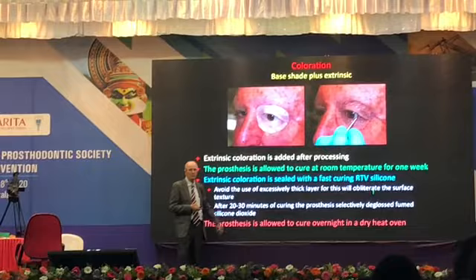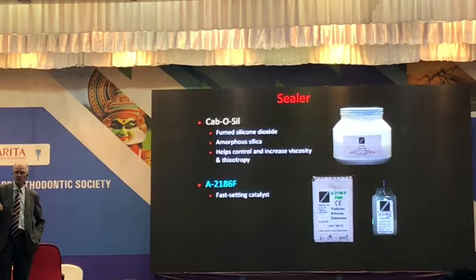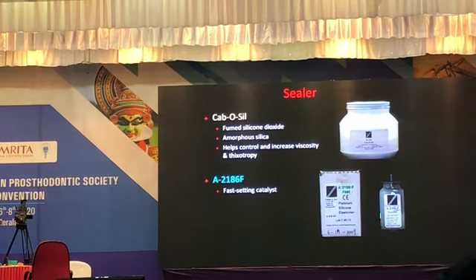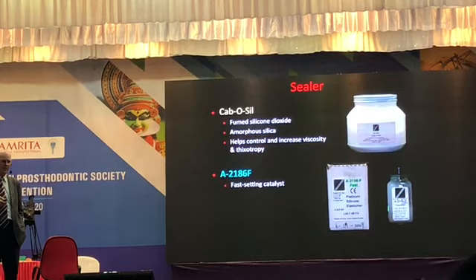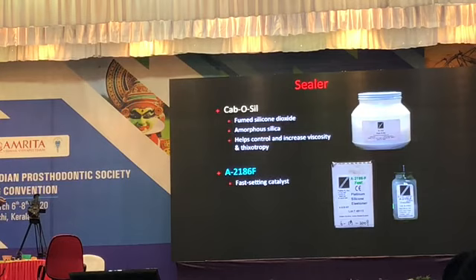And then you seal it with an auto-polymerizing silicone, and then you have to degloss this. When you seal, the surface will be excessively shiny, and so you have to use a material to eliminate that shininess, or at least moderate it somewhat. And noses sometimes will let it still shine on the nostrils a little bit, and maybe the tip, because a lot of older people have a lot of sebaceous secretions, and their nose shine a little bit. You don't want to do too much elimination of the shininess, just the right amount, and that should be done in the presence of the patient.